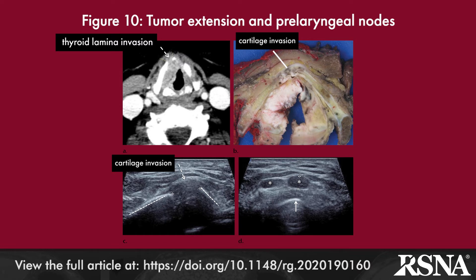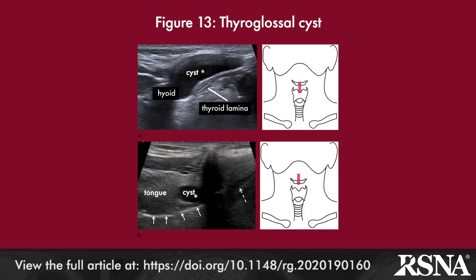Regional nodal status is also assessed by ultrasound, where pre-laryngeal or delphian nodes — which are an important route of lymphatic dissemination in laryngeal cancer — can be more easily seen and distinguished from the strap muscles than on CT or MRI. For benign laryngeal disease, ultrasound can readily detect saccular and thyroglossal cysts.